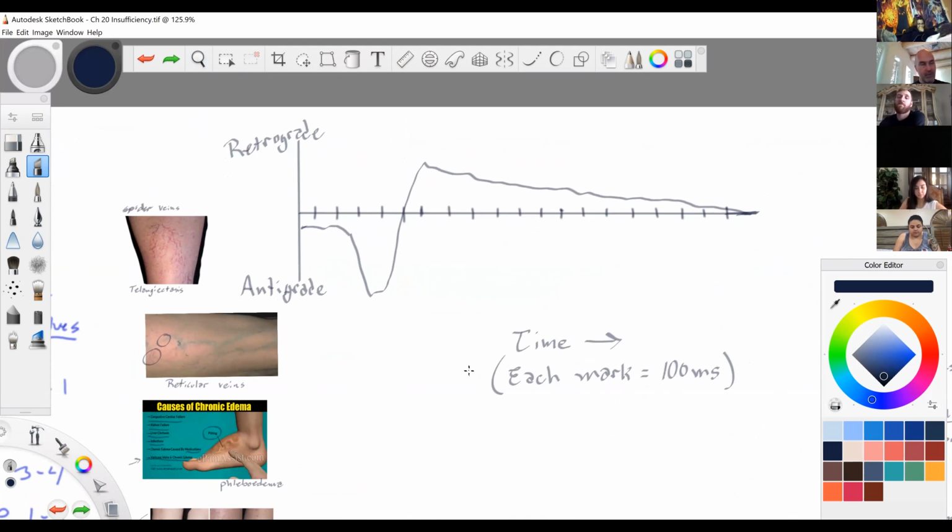Standing. Well, actually, before they're standing, we're going to do a quick DVT study. If you find acute DVT, which would be pretty unusual, but possible, you're done, because the only thing to worry about at that point is the acute DVT, because they can kill you. They cause a pulmonary embolism. If it is obviously older DVT, DVT that has begun to dissolve and even reopen, then you can continue with the exam.